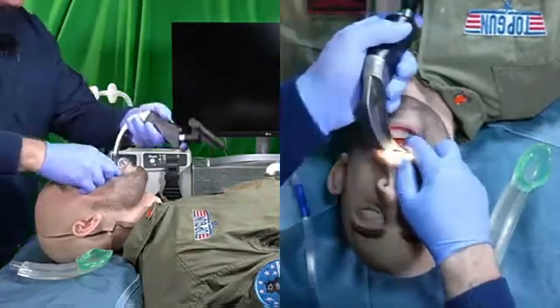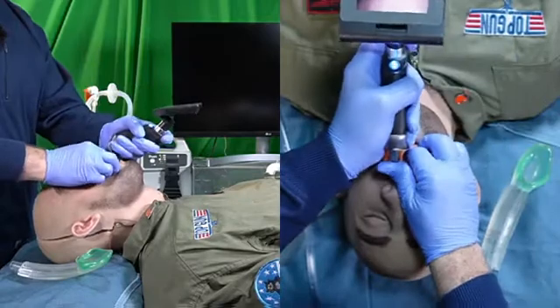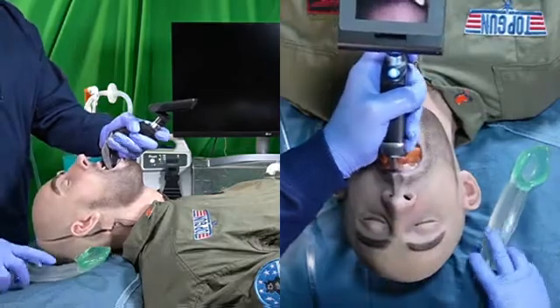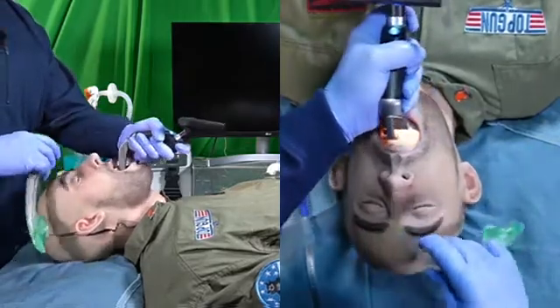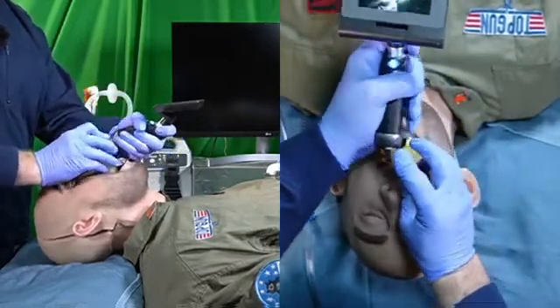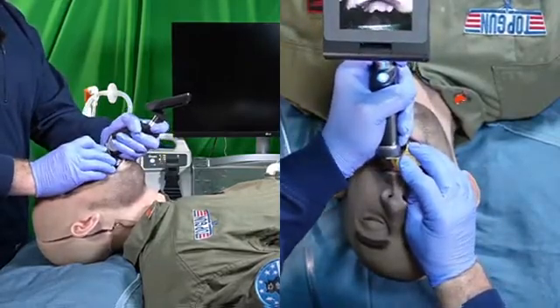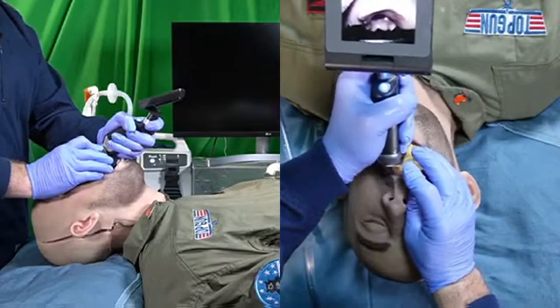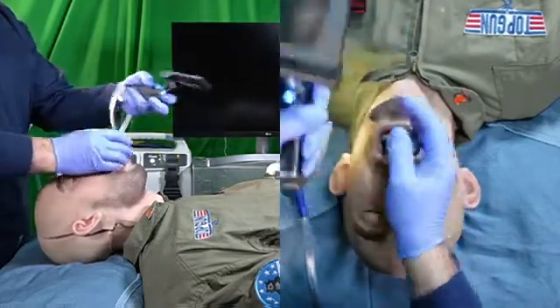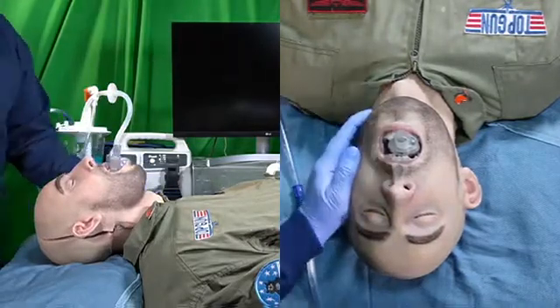So I'm going to just visualize the hypopharynx with this video laryngoscope, and so we're just going to show basically the hypopharynx. I'm going to use this as a distracting tool to place the supraglottic underneath the tongue and larynx into where the tip of the supraglottic goes into the upper esophageal inlet. And you can see as I relax the laryngoscope that the epiglottis rests on the heel of the airway, and this is going to permit me the ability to have a great position and seal now.